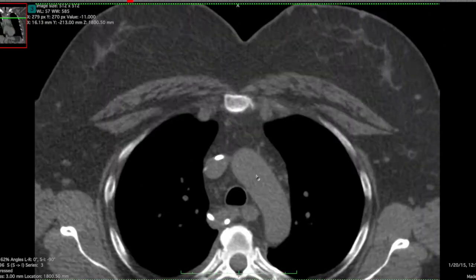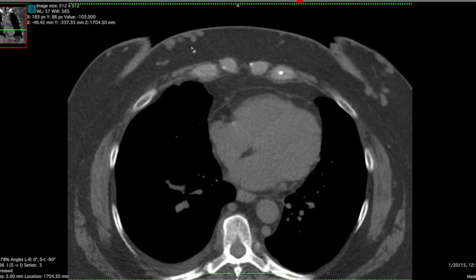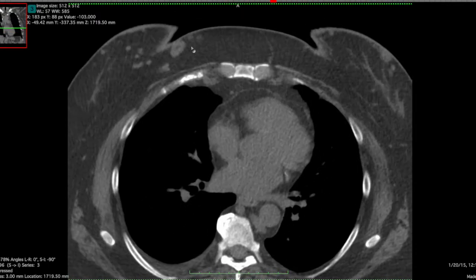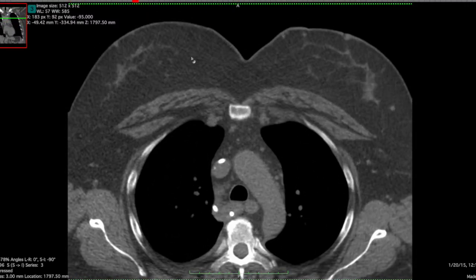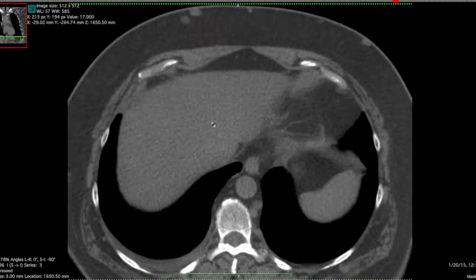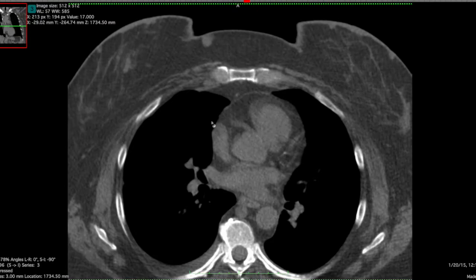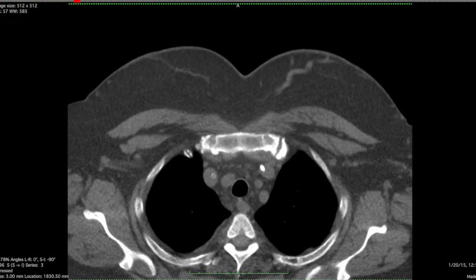And if we look more anteriorly, you're going to see these collateral vessels, which are obviously in reaction to that superior vena cava obstruction. Also note the enlarged internal mammary vein on the right — these collaterals form trying to get around that severe SVC narrowing or perhaps even obstruction. No contrast on this. It's actually pretty amazing how much you can tease out in the vasculature even without giving contrast. A nice lesson there.